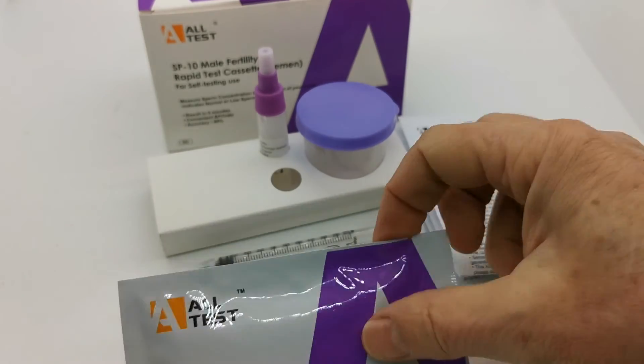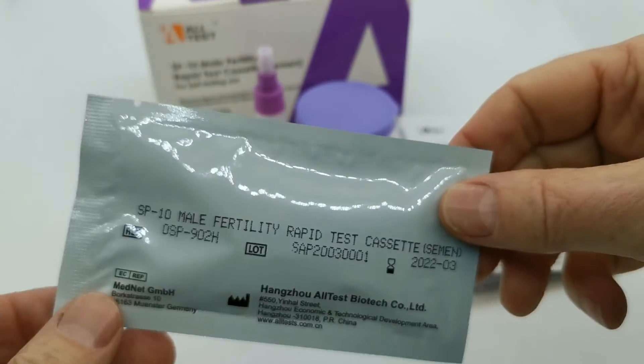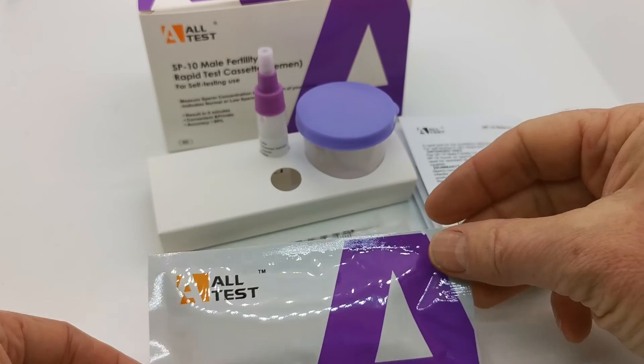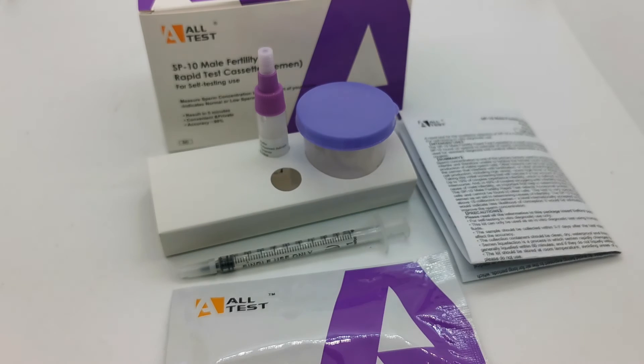The cutoff on this test cassette is 15 million sperm per mil, which is the WHO guidance on what is considered a baseline male fertility level for normal fertility.